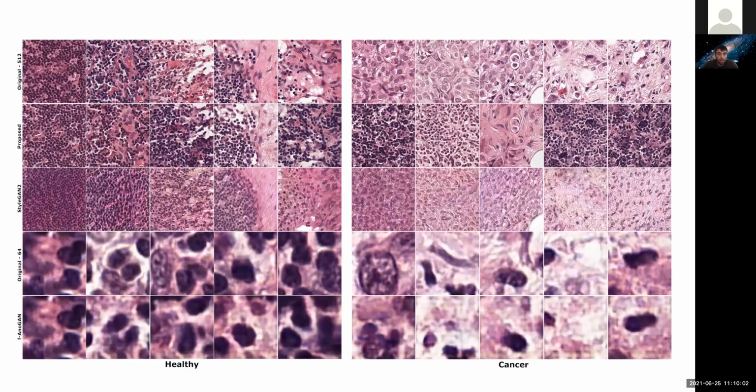So here we also present example reconstructions of healthy and cancer tissue samples for all the methods. We can see that the proposed method reconstructs healthy samples much more accurately in comparison with, for example, the StyleGAN2 method. Some level of artificial healing is visible on cancer samples, where we can see visual appearance much more closely resembling healthy samples. The F-AnoGAN method, for example, is only able to operate on 64 by 64 patches, where we similarly notice that better reconstructions were obtained on healthy-appearing samples.